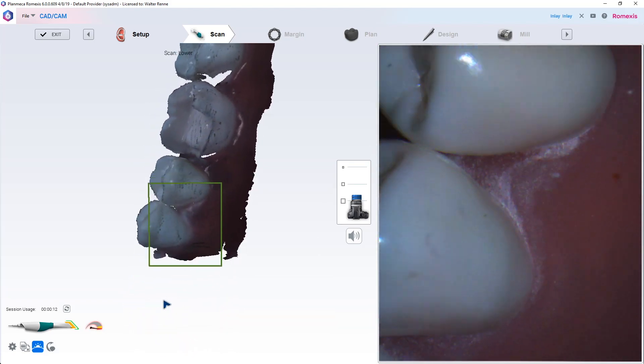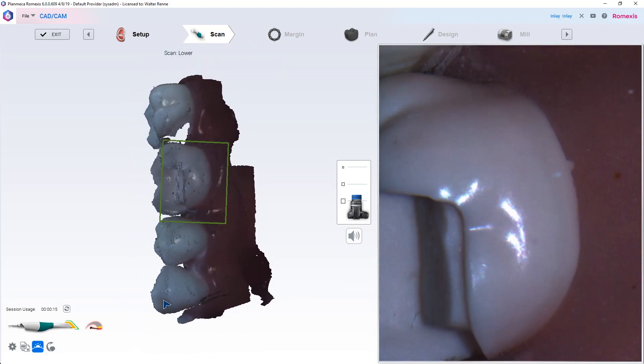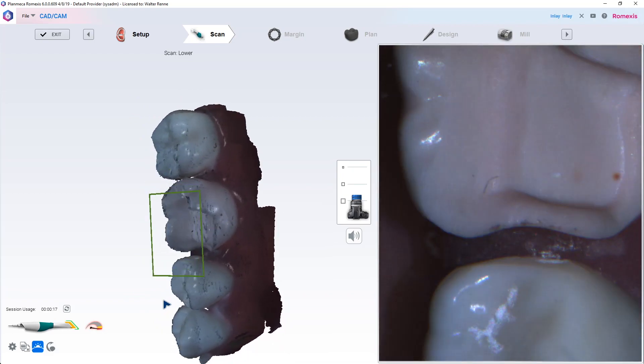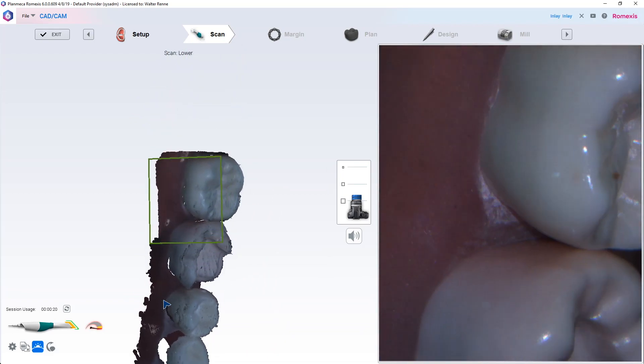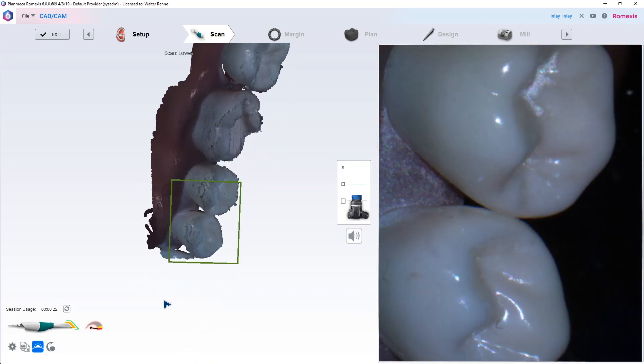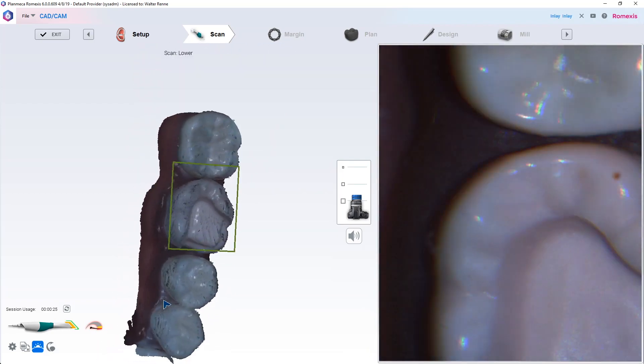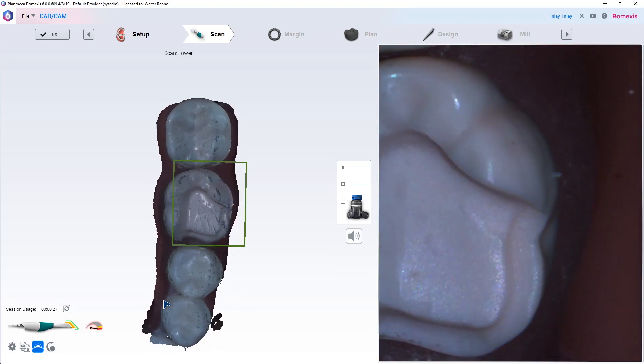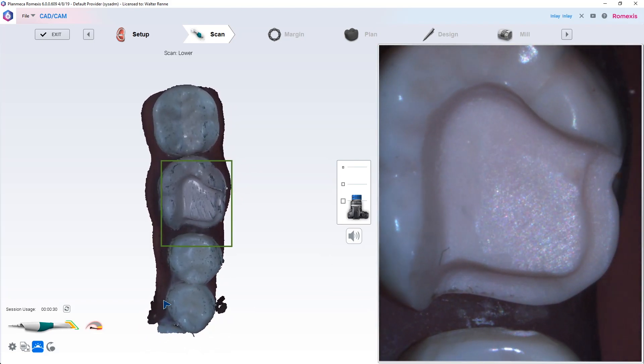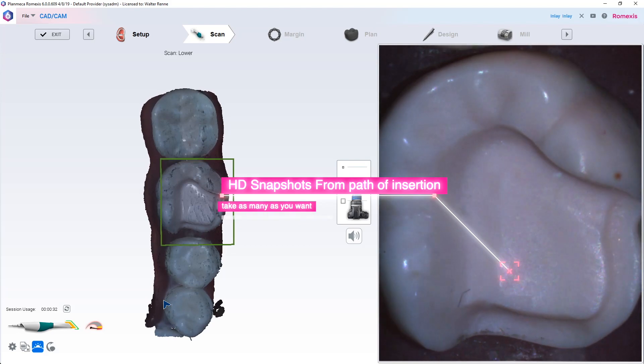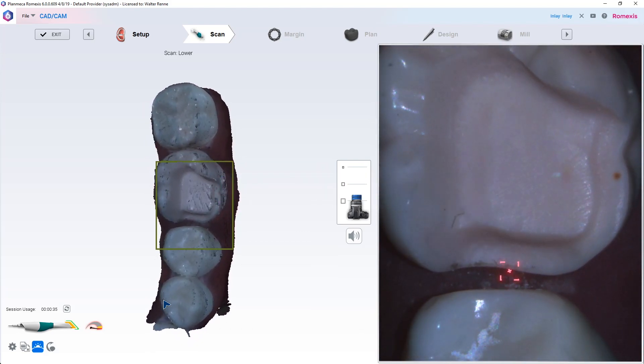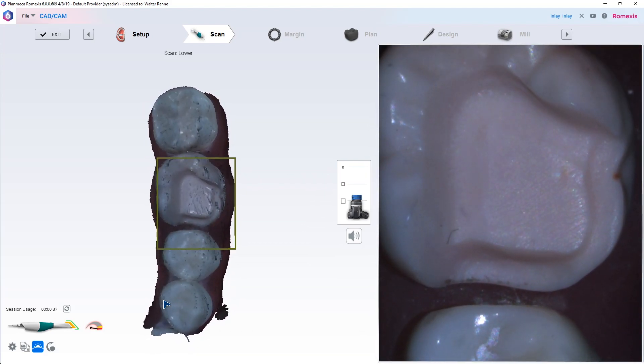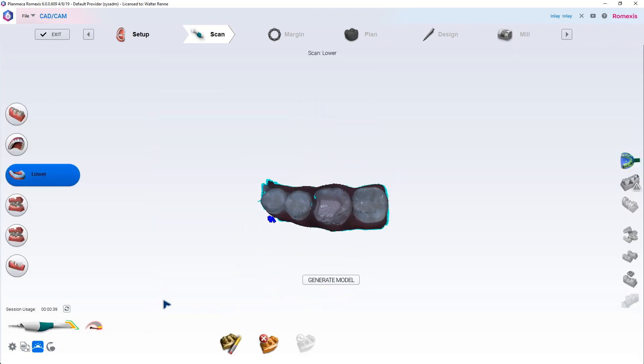It doesn't really matter the sequence. You just obviously have to overlap your scans in such a manner that the computer is able to use common points of interest between each individual image. And then, of course, you can do some HD snapshots. I usually take a few for each prep, kind of rotating ever so slightly, changing my angle. These things are looking real hot clinically when I do that.